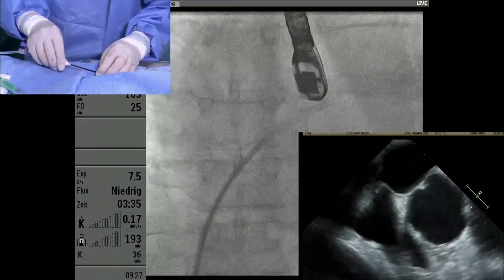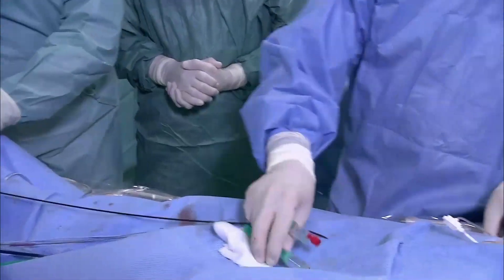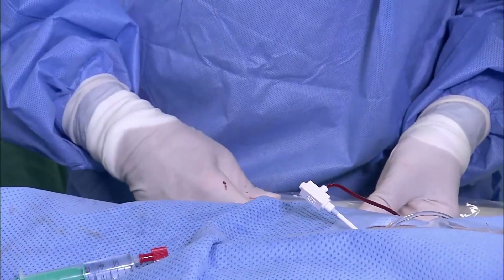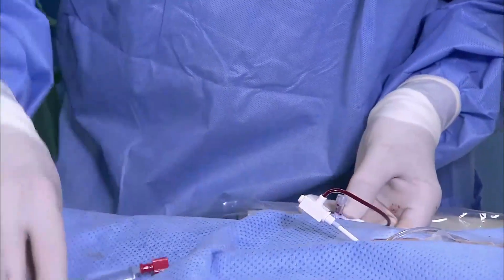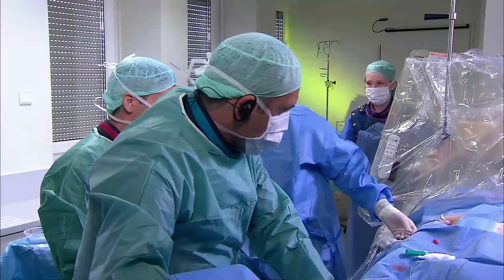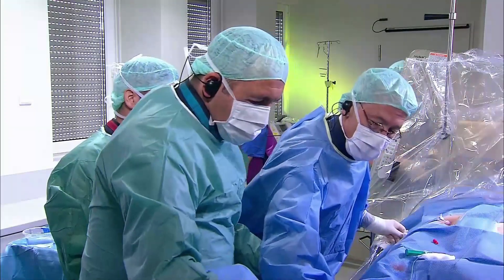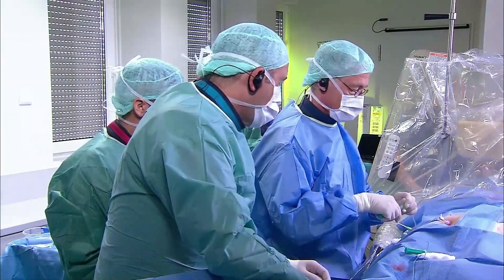I already gave 3,000 units of heparin when I inserted the sheath in the groin, so I will give the remaining dose now, which will be a total dose of 10,000 units. The next step - I will need the multipurpose catheter, which should be on the table, and the six-French sheath in order to seal the valve of the transeptal.